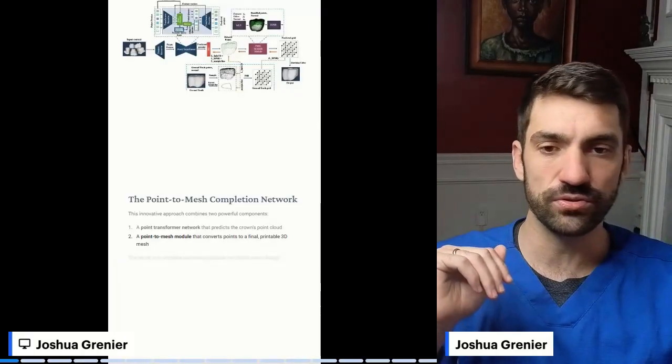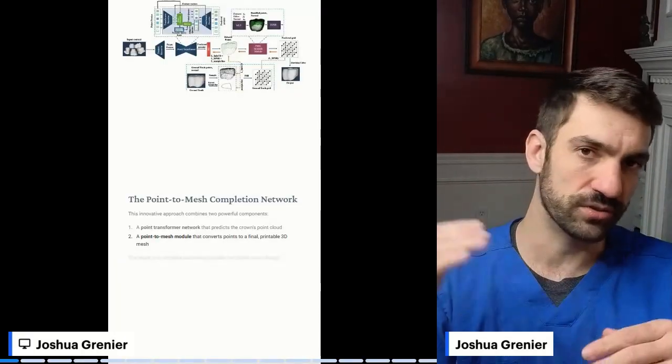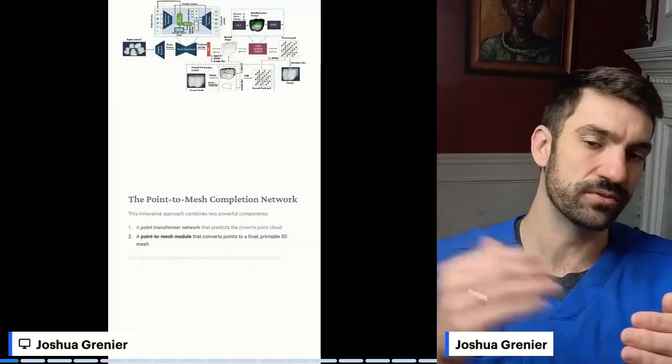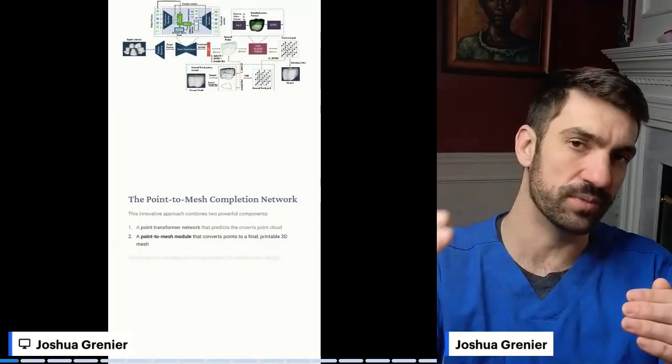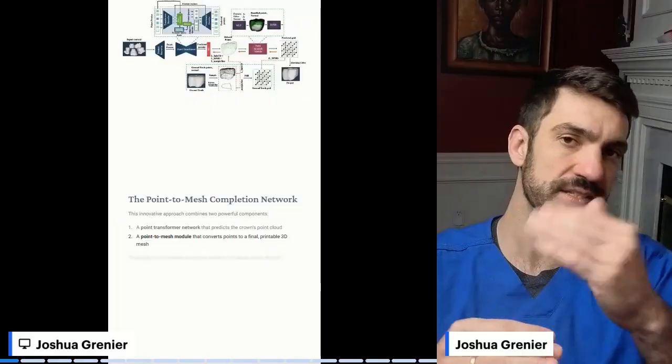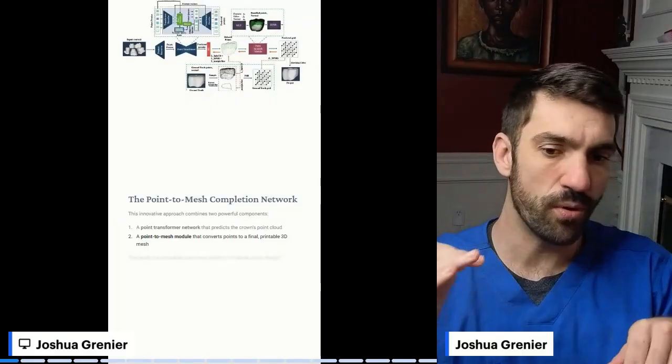And then it's using a transformer model with a dynamic number of queries. So it can essentially ask questions continuously. Where would this point go? Where would be the best feature region? And it can spit out a potential point.